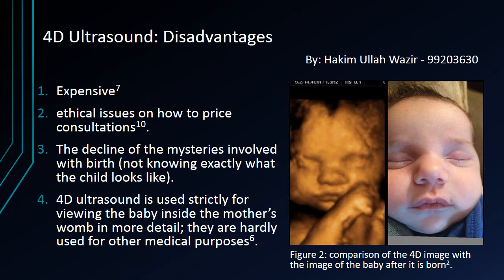Number 3. The decline of the mysteries involved with birth, so not knowing exactly what the child looks like. Number 4. And finally, 4D ultrasound is used strictly for viewing the baby inside a mother's womb in more detail. They are rarely used for other medical purposes. I'll hand it down to Fatmah, who will be concluding and summing up the topic of 4D ultrasound.